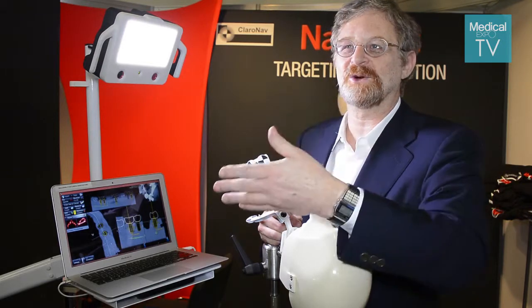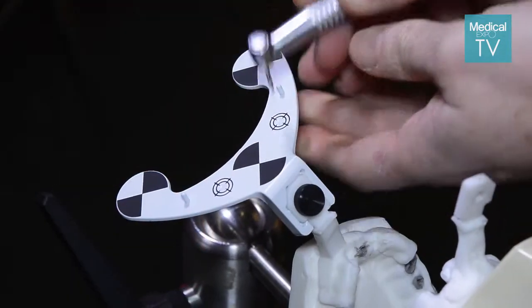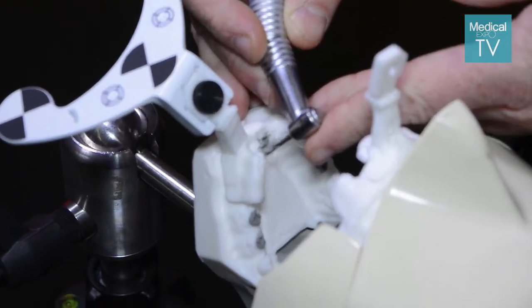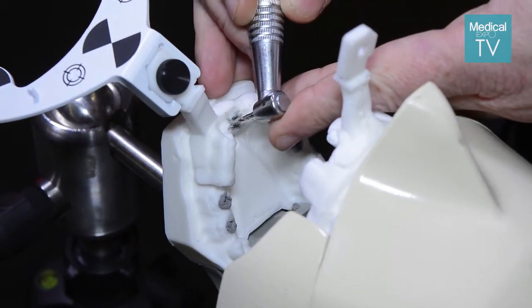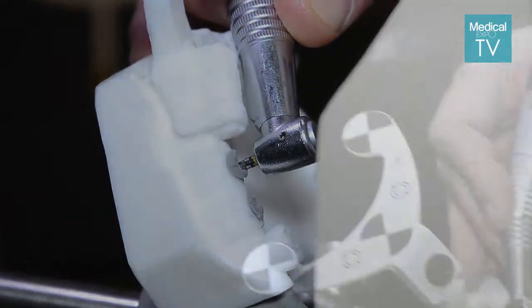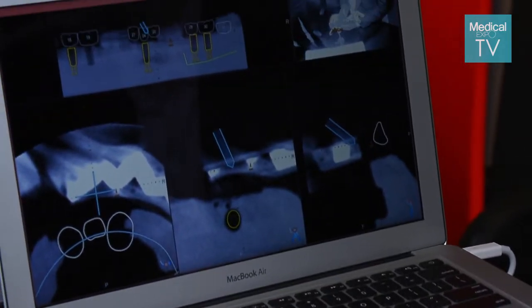You don't have to send work to the lab and get the work back and so on — the whole thing is done on the spot very quickly. The final stage is actually placing the implants where you planned, and that stage our tracking camera tracks the position of the handpiece and tracks the position of the jaw during the surgery.